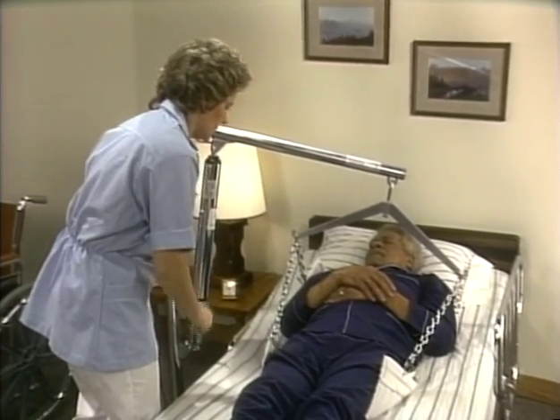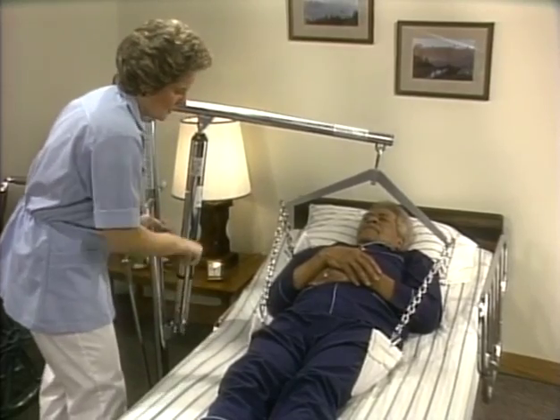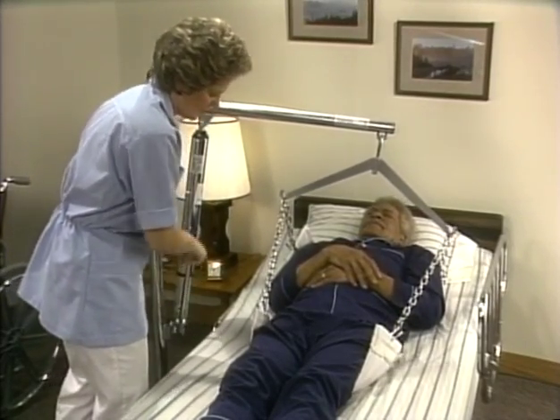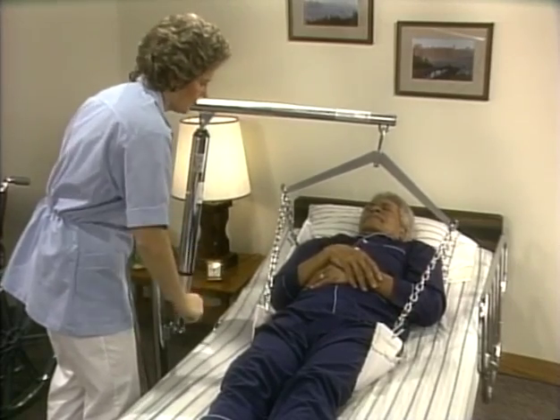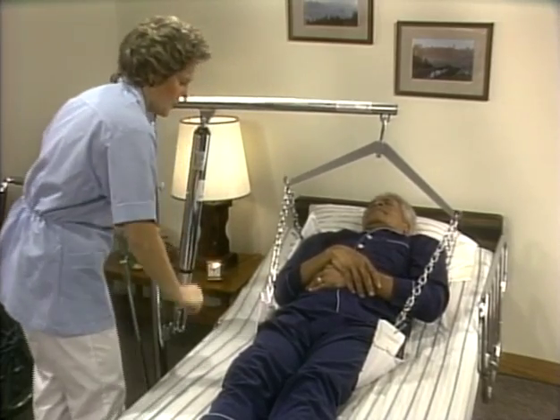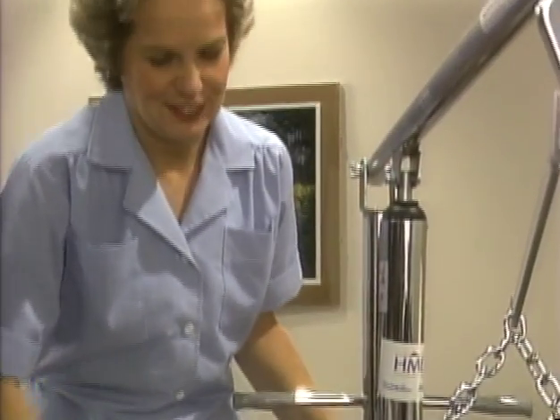Pump the hydraulic handle. Hold the steering handle with your other hand to steady the pumping action. Use a slow, steady, strong pumping motion. Make any adjustments necessary for the patient's comfort. Some patients may need support for their heads during the lift. Watch the patient's reactions. His comfort and safety are your primary concerns. You'll probably notice that you'll exert more effort in pumping as you raise him further off the bed.